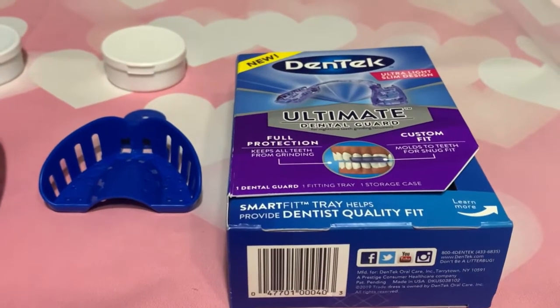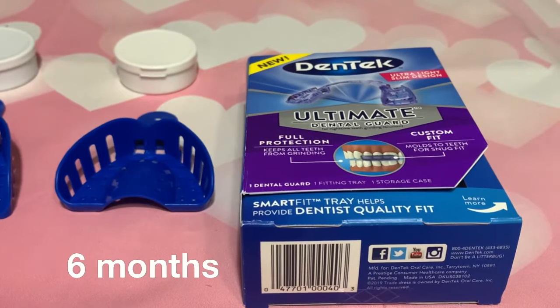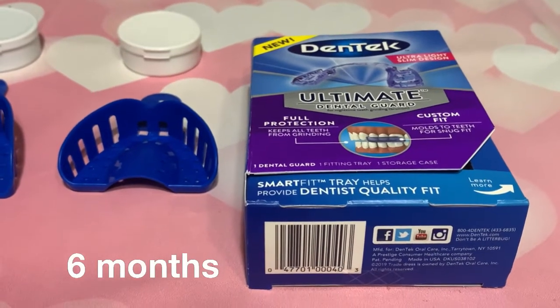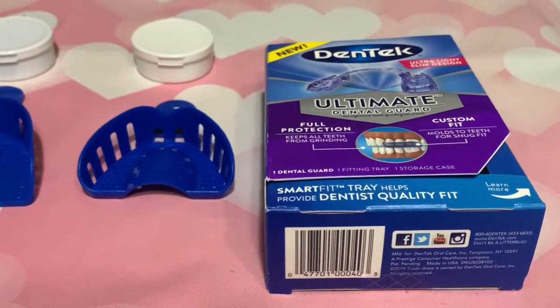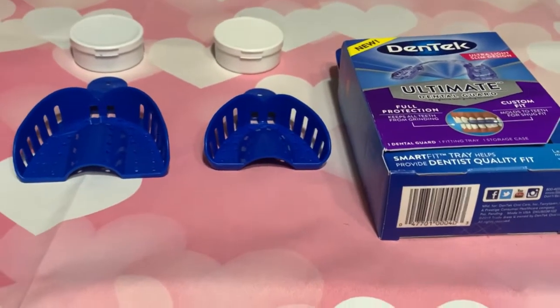Now, this was doing really good. They last for about 6 months, and then the space between the upper and lower jaw starts to get a little closer because it's wearing out.